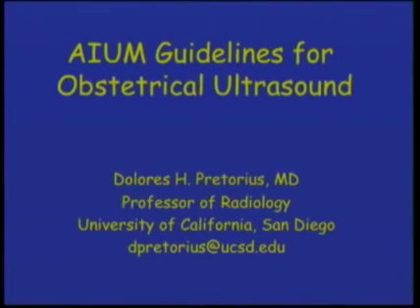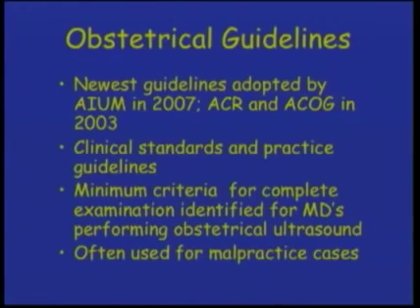I'd like to talk to you about the AIUM guidelines for obstetrical ultrasound. The newest set of guidelines were adopted by the AIUM in 2007. Previously, the American College of Radiology and the American College of Gynecology had adopted the same guidelines in 2003. These are clinical standards that we can use as practice guidelines. They are minimum criteria to complete the examination, which has been identified for physicians performing obstetrical ultrasound, and they're often used as a basis of a standard of care for malpractice cases.